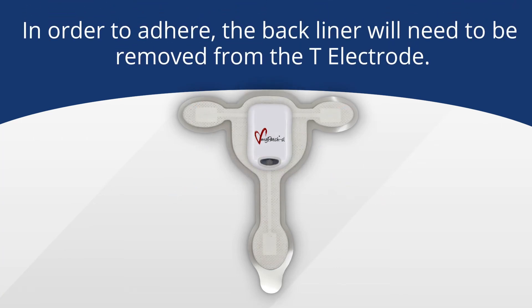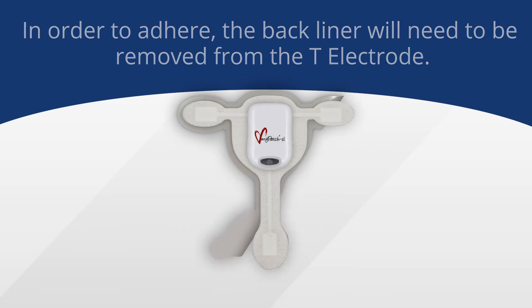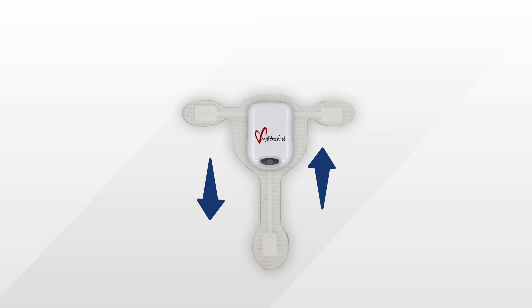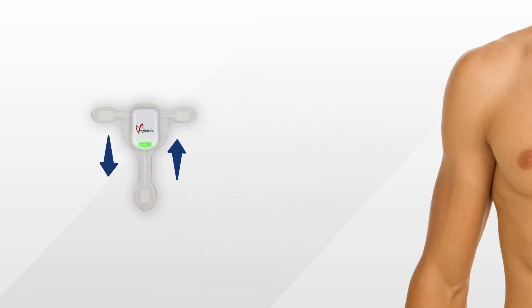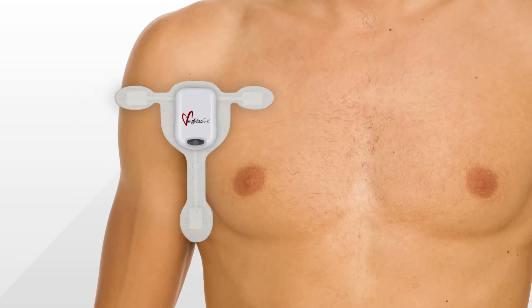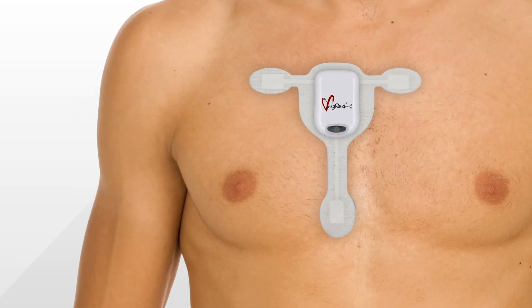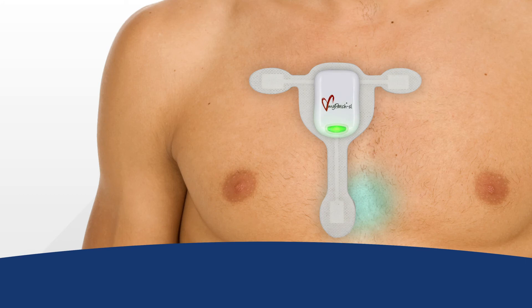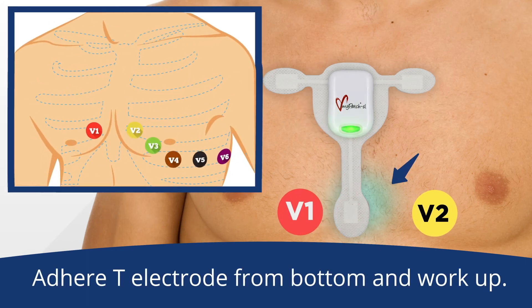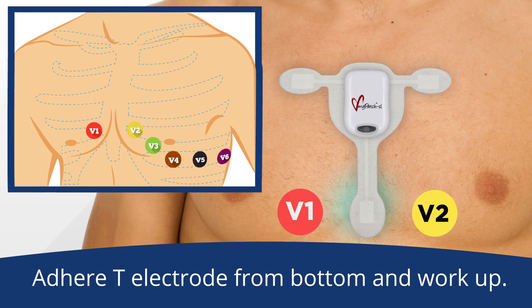After the MyPatch SL recorder and T electrode have been connected, you're ready to put the device on the patient. Carefully remove the back liner from the electrode. When applying, it's important to note that the recorder needs to be straight up and down. In order to correctly position the T electrode on the patient, start by adhering the electrode gel on the bottom of the T electrode to the center of the sternum between positions V1 and V2. Press the electrode up to the sternum, patting firmly as you go.